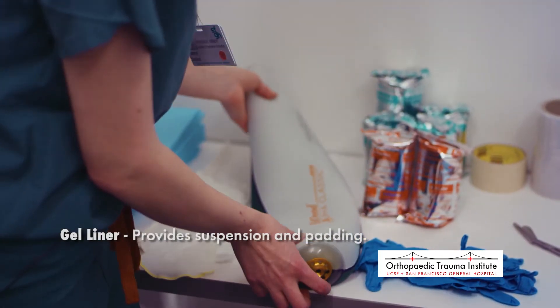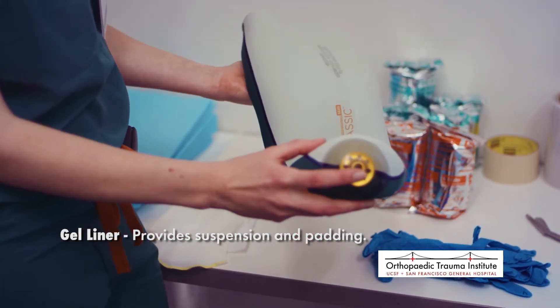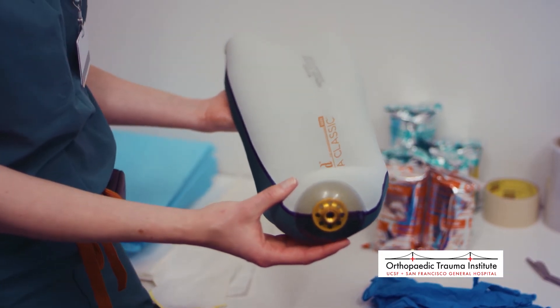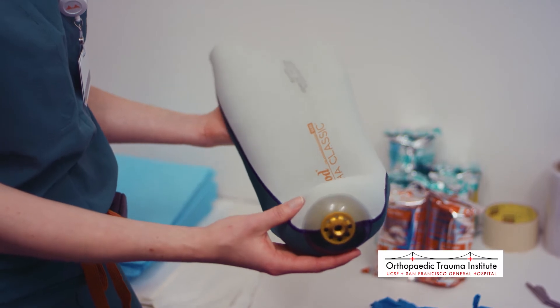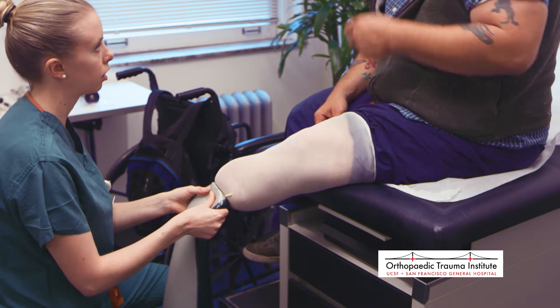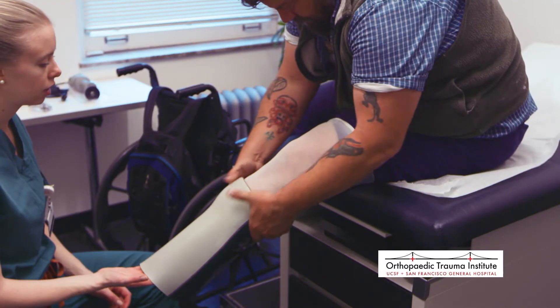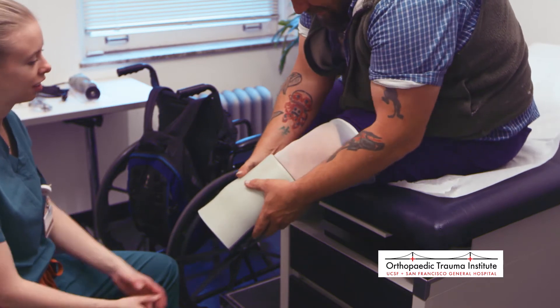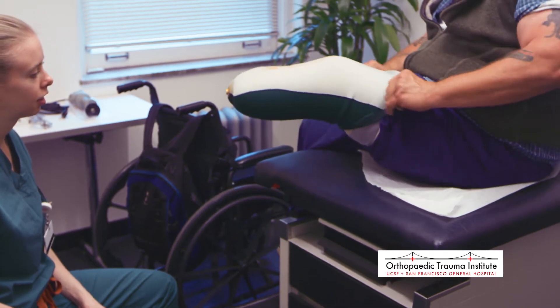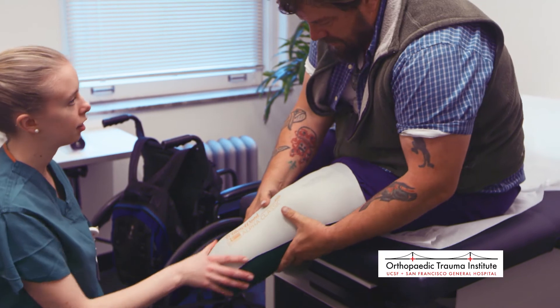Next, we have our gel liner, which in this case is a locking liner to be used with a locking suspension system. We don't use this style for everybody, but it's one of our more common liners. We roll it straight onto the skin — turn it inside out first. It's cushioned on the inside to provide relief for bony prominences, and the gel is sticky when rolled onto the leg, providing suspension and padding.